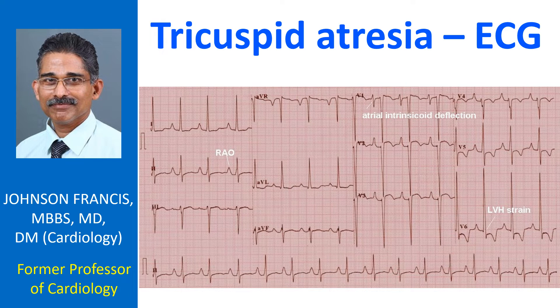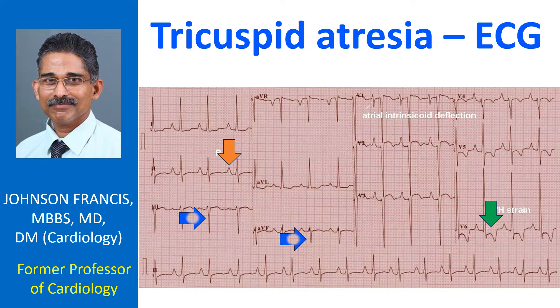Right atrial overload is manifest as tall P waves in lead 2, and left ventricular hypertrophy with strain pattern is seen in lateral leads with tall R waves, ST segment depression, and T wave inversion. The axis is leftward with predominantly negative QRS in leads 3 and AVF.